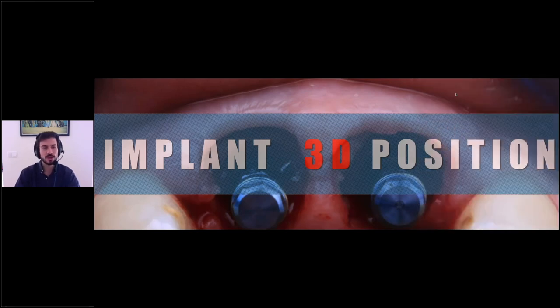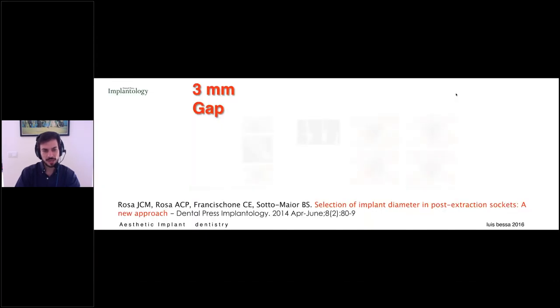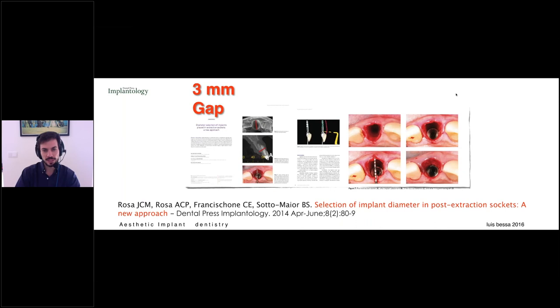If it's the same or more, we can use a regular implant. And if it's more than 9, we can use a wide implant. But I never go for a wide implant in the esthetic zone. If we select the implant with the rules of this article and with this protocol, we are always able to achieve a 3 millimeter gap, which for me is more or less the ideal, because we'll have a good emergence profile of our restoration without touching the root, because this could be a serious problem.